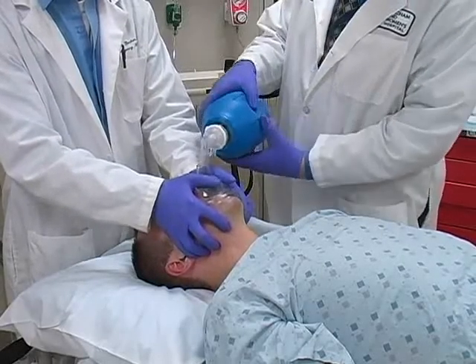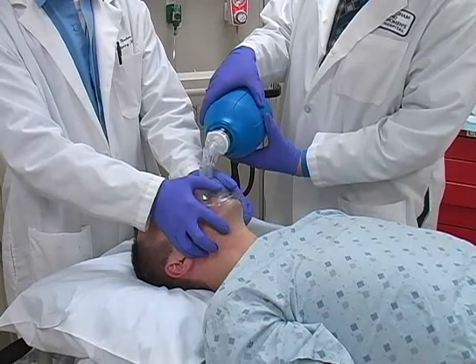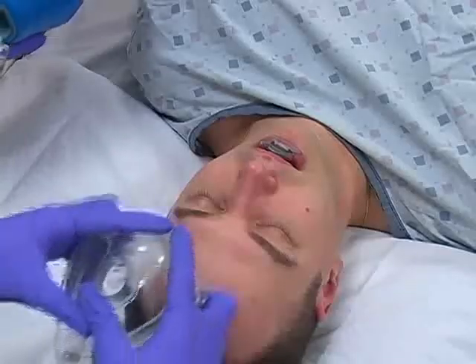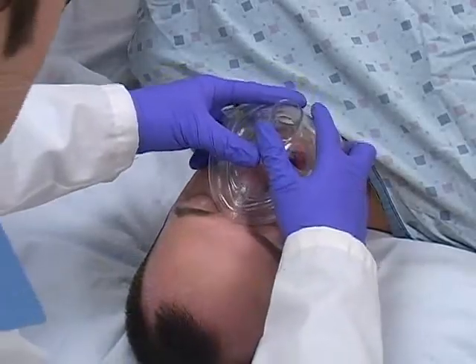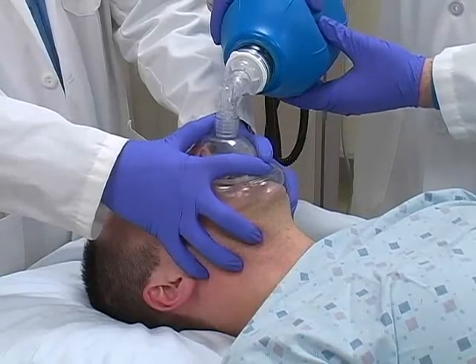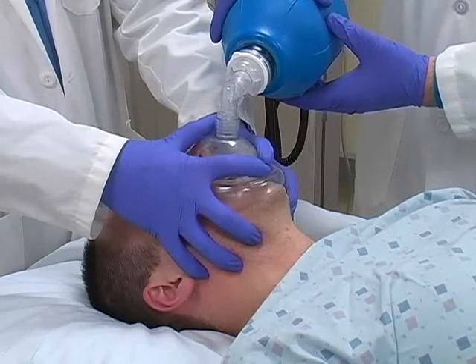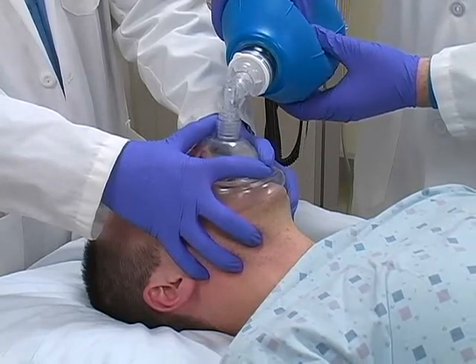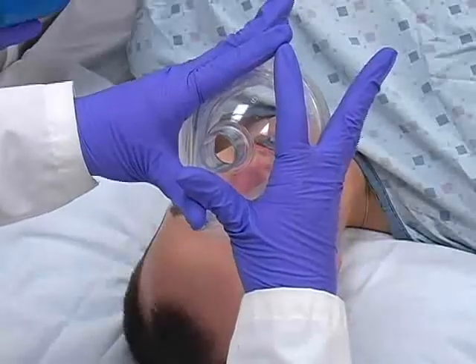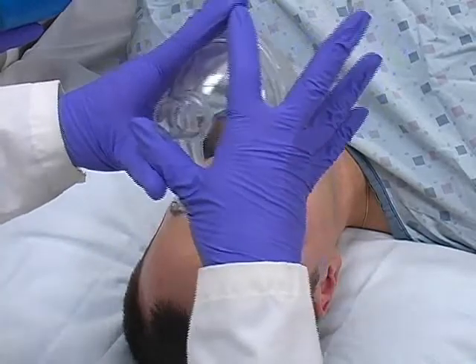2-person bag mask ventilation is more effective than the single-person method and should be utilized if possible. In this technique, one clinician is responsible for maintaining a proper mask seal, while a second clinician squeezes the bag to provide ventilation. The more experienced clinician should handle the mask, since it is the most difficult aspect of this procedure. The first provider holds the mask in his hands in a fashion similar to the 1-person technique.